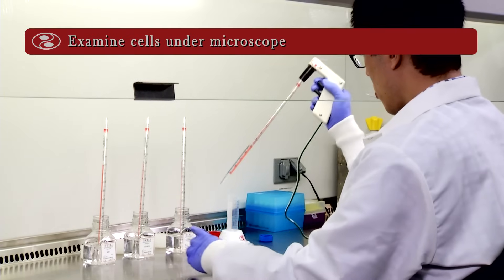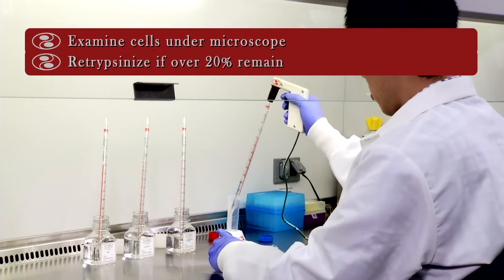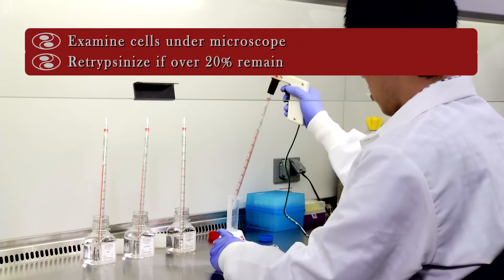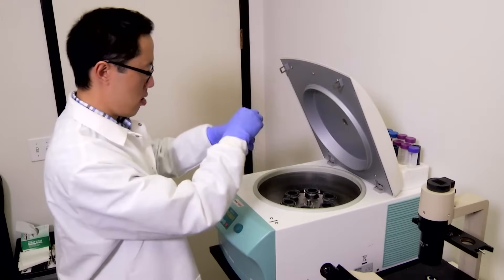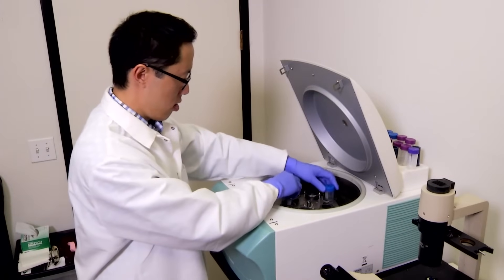Examine cells under microscope. Retrypsinize if over 20% remain. Pellet cells at 220 times G for 5 minutes.